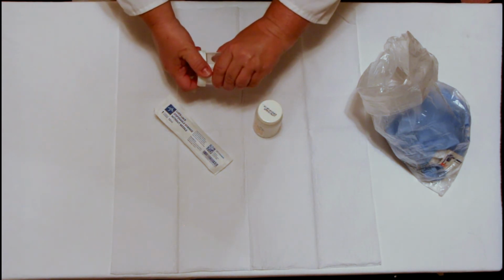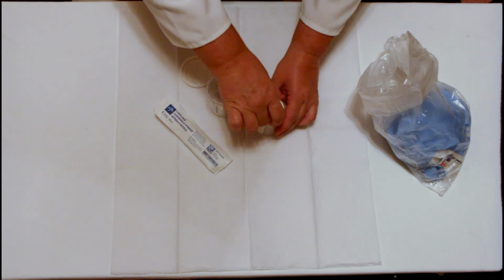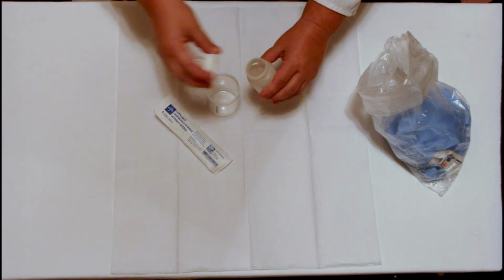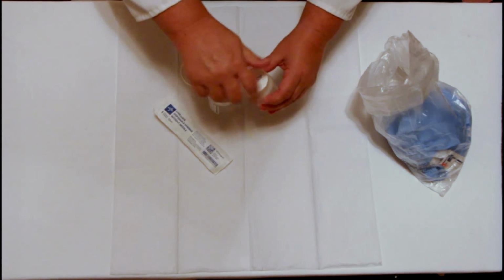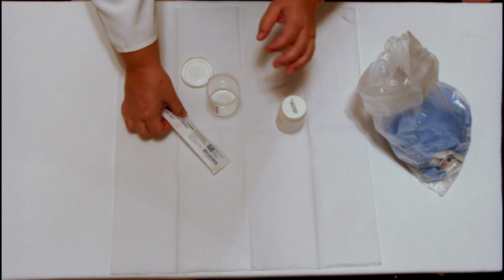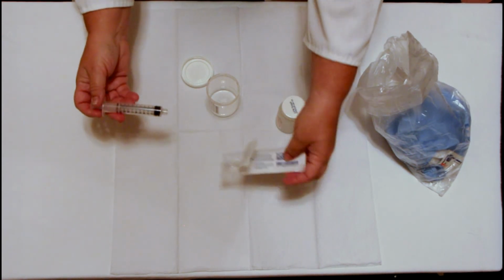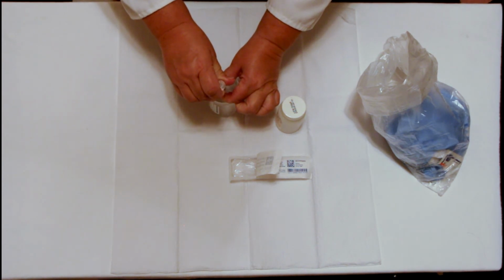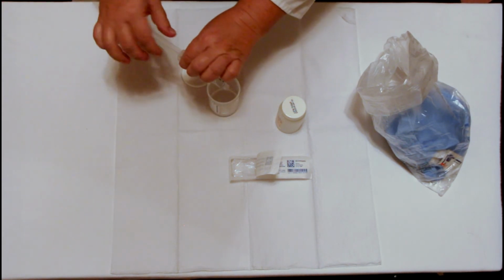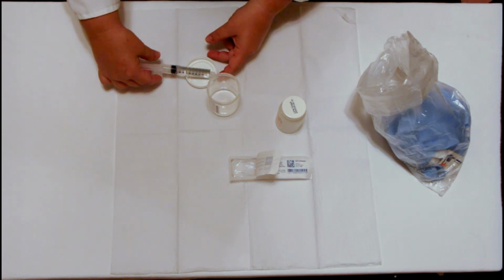If the order requires irrigating the wound using a syringe, pour the irrigation solution into a clean specimen cup. Withdraw the required amount into a syringe. Be careful not to allow the syringe to rest in the cup.